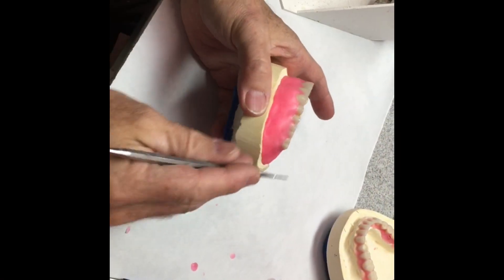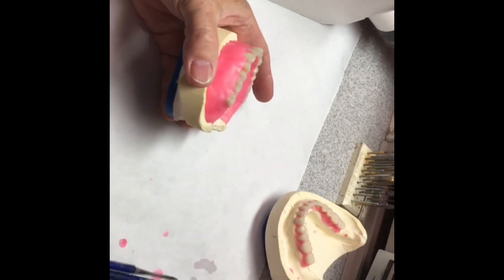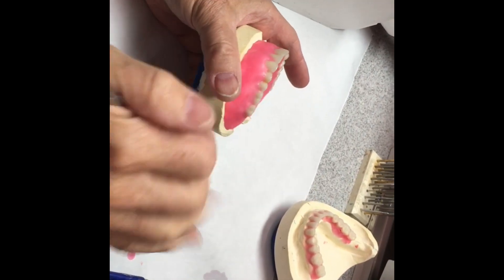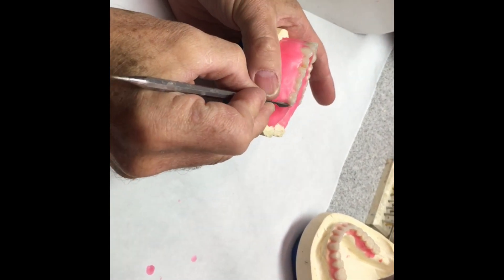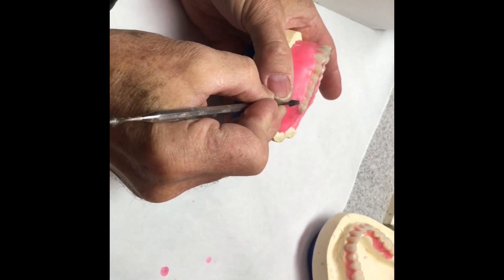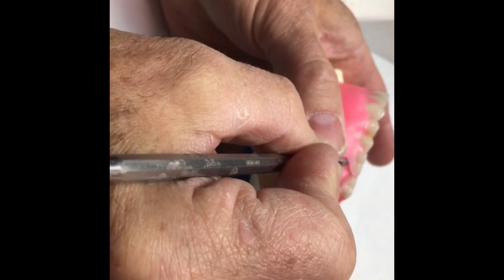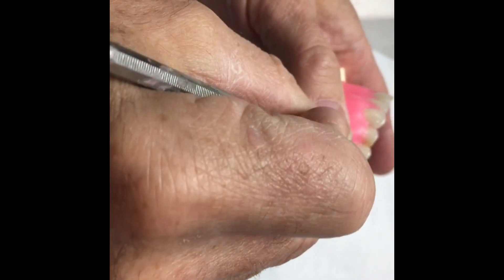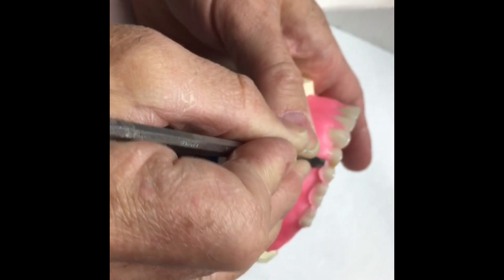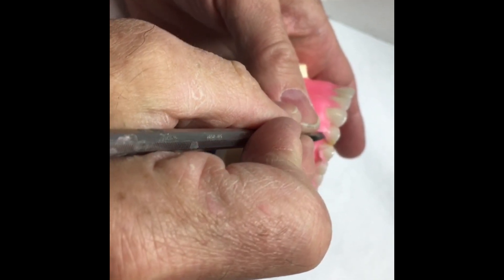Now I've added my wax and I've flamed it with an alcohol torch. I'm going to carve the gingiva — I'm going to festoon this, at least on the facial of this quadrant. I'll take a roach carver, coming at it from this angle. I want to cut down to the cementoenamel junction — the CEJ — of the denture teeth. This particular one is an immediate, and we're festooning it for processing, not for a wax try-in.